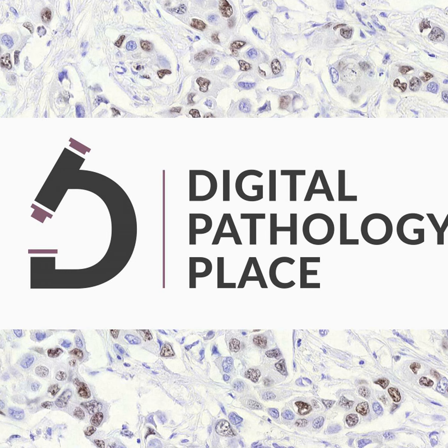Yeah, some context maybe is that when you collect the data in a form called a data pyramid, it's analogous to being able to zoom in and out, and you're right. It would be very challenging to look at every pixel of a 40x image of a large resection. That's not how pathology's done. On the other hand, the actual areas where you need high versus lower magnification is very case specific and dependent on the pathologist's preference.